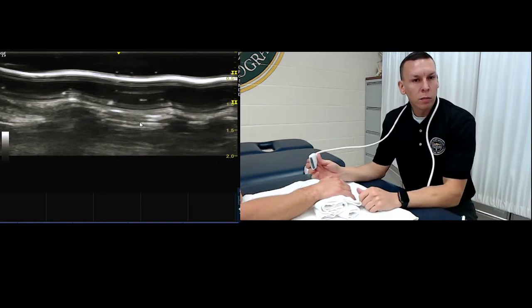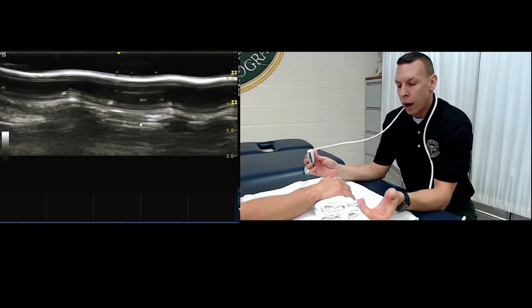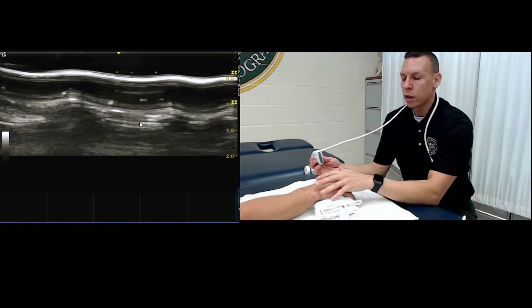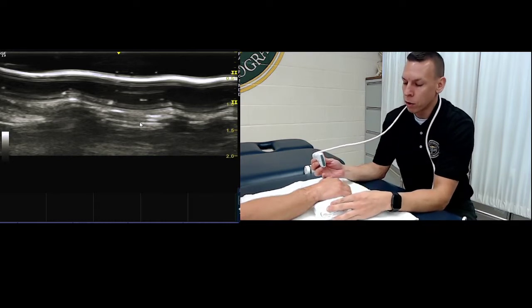All right, welcome to the scan along video for the wrist and hand. For the wrist and hand, I like to start with the dorsal side of the wrist first, and then do the rest of the hand, and then flip it over onto the image of the palmar side.